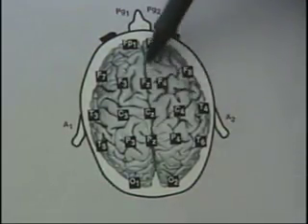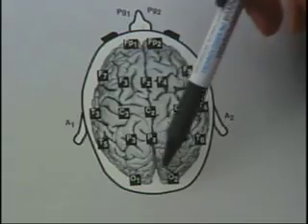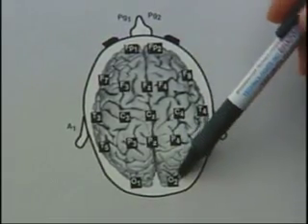The Z, of course, is the central areas. And then finally we have O1 and O2 on the rear of the head.